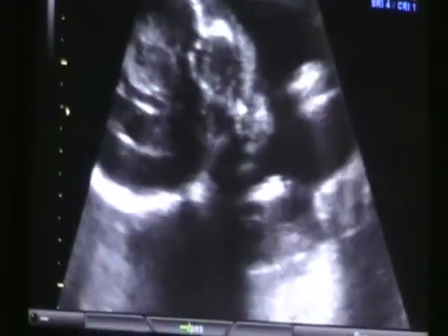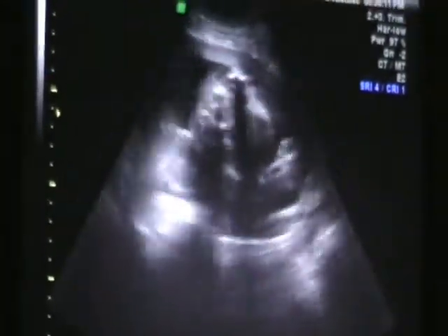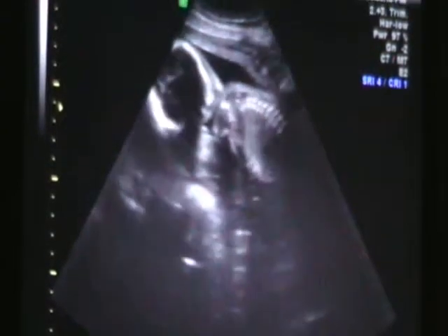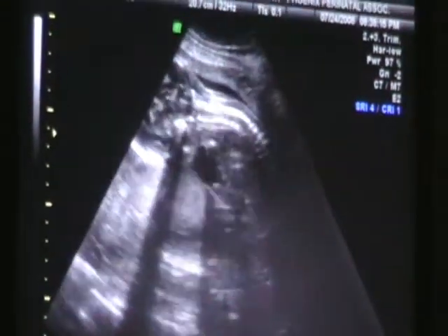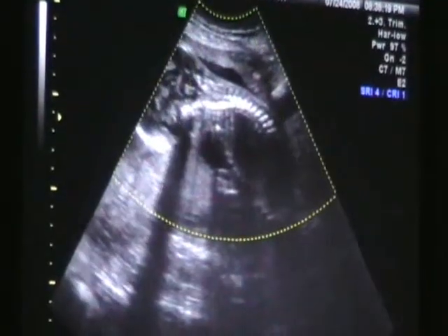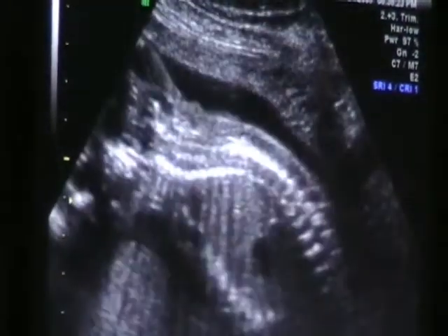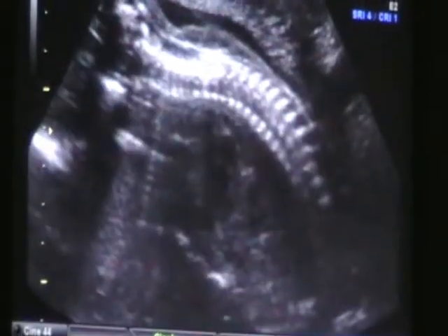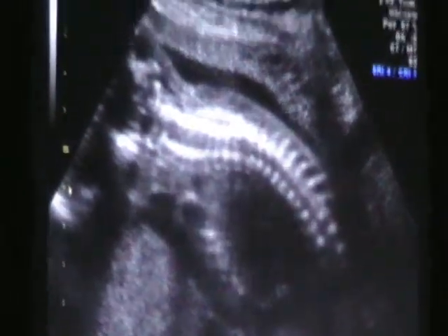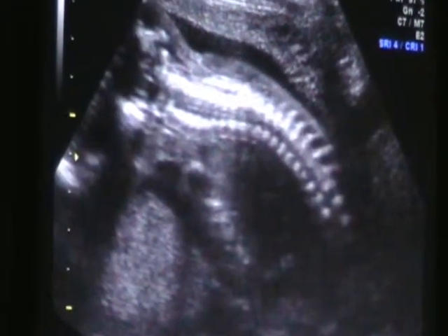This little one — I'm going to try. She doesn't want to show me the floor. I wish it was that easy. There's her head and neck right there. We want to see some spine. A little bit right here. That looks good. We're going to try to follow that all the way down. She's trying to hide her back.